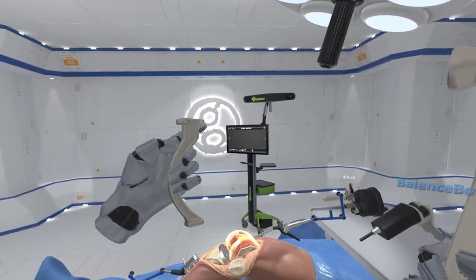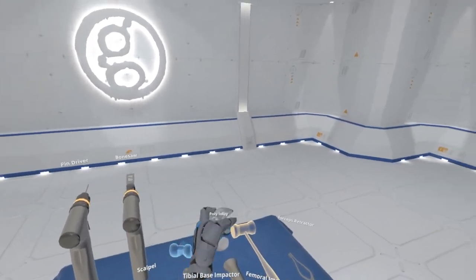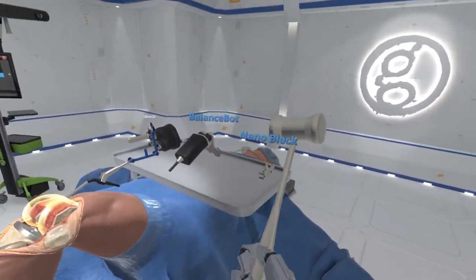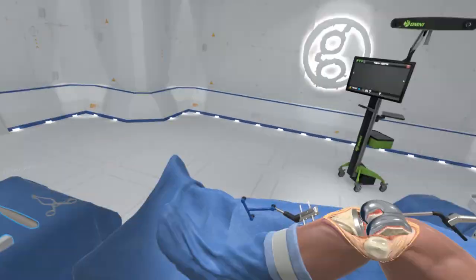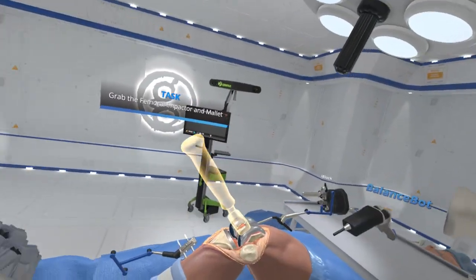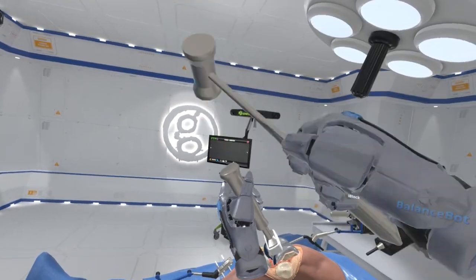Pick up the femoral shell. Approximately place the femoral shell onto the prepared distal femur. Grab the femoral impactor and mallet from the Mayo stand. Place the impactor on the femoral shell and hold it in. Now strike the impactor strike pad with the mallet to seat the femoral shell.